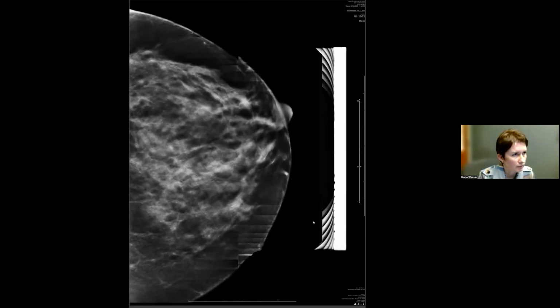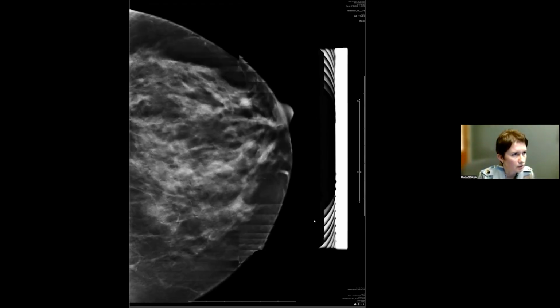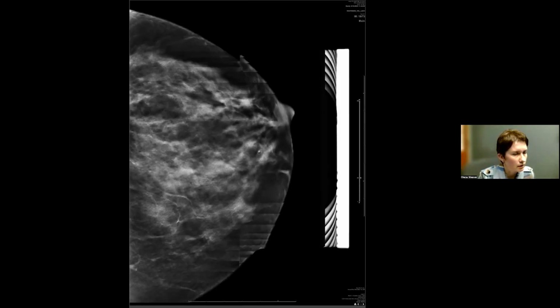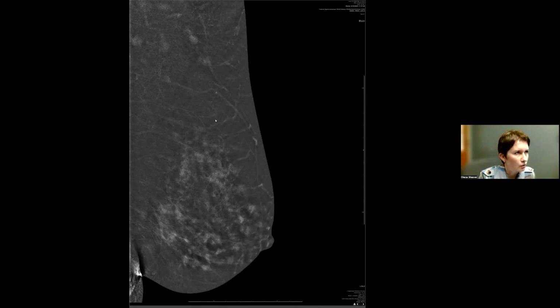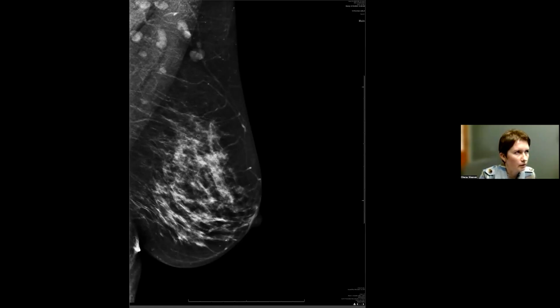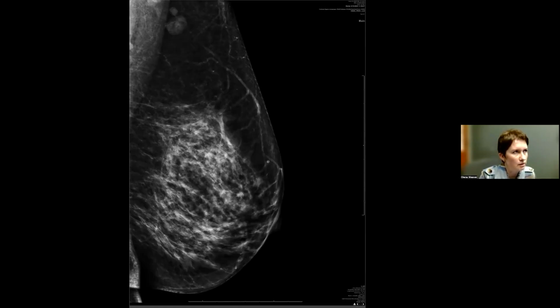So this is an example when we did spot tomosynthesis on that case. And this is an MLO view. Notice how you do not really see the pectoralis very well on recombined images. You do see enhancing lymph nodes. But again, the beauty of it is that you can cross-correlate with the low energy images under the same compression. And this was a lateral image.